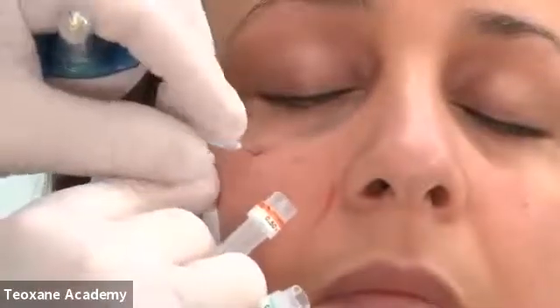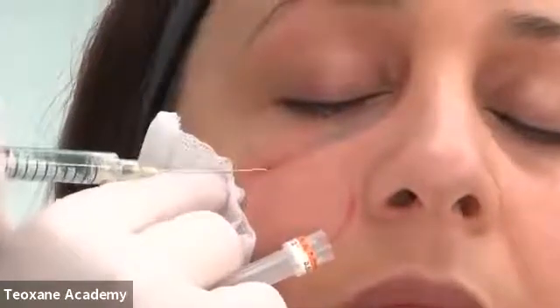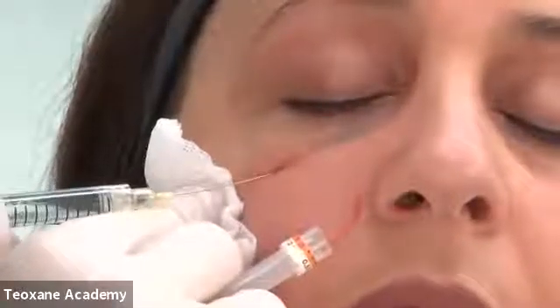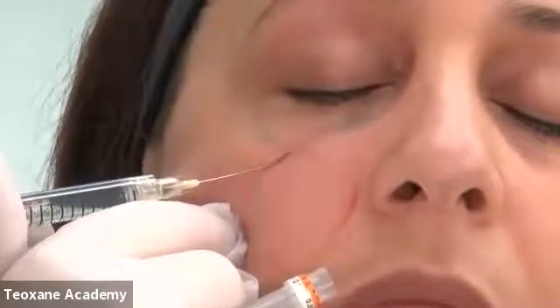Then I will introduce my cannula, and for that I will use my 25 gauge cannula, deep on the bone, and then I will follow the path of this area. So here you see I'm introducing my cannula, going deep on the bone here, and sliding slowly on the bone, and I'm going to follow the direction of my tear trough. So here I'm deep on the bone and going slowly.